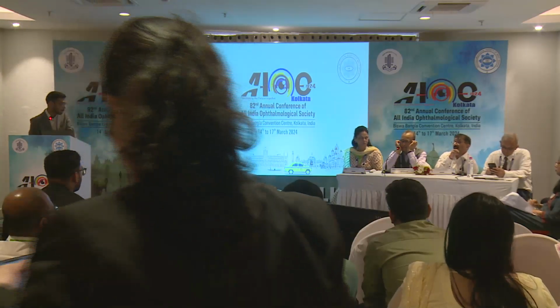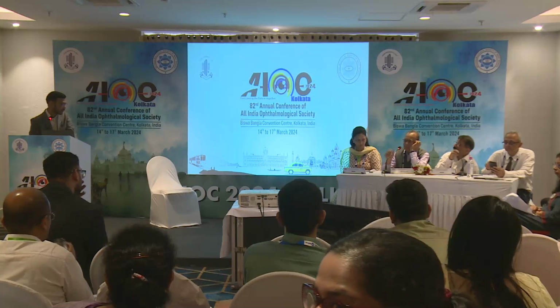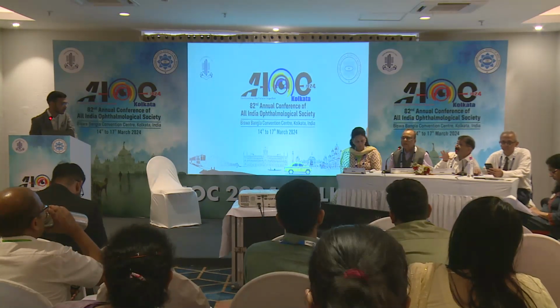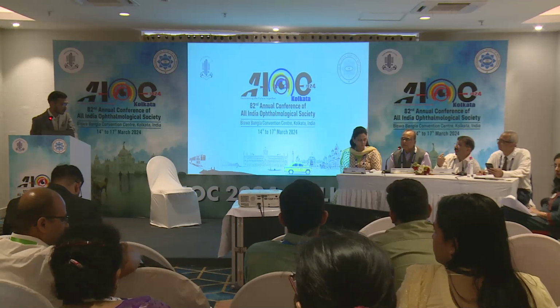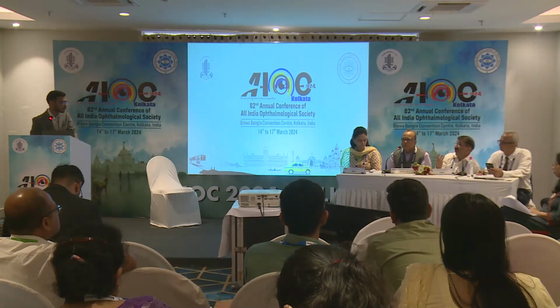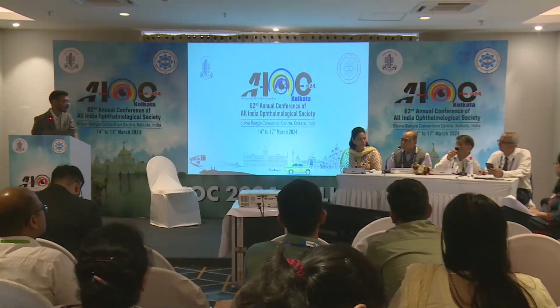In GCC we also use the ganglion cell complex. We use the ganglion cell, we use the RNFL. But what we exactly need is simply the ganglion cell layer. Since the instrumentation is such that we cannot measure that single layer, there's a problem in measuring it. So all three layers are measured usually. And then to include all the layers of the macula, that's a bit, at least I can't explain.